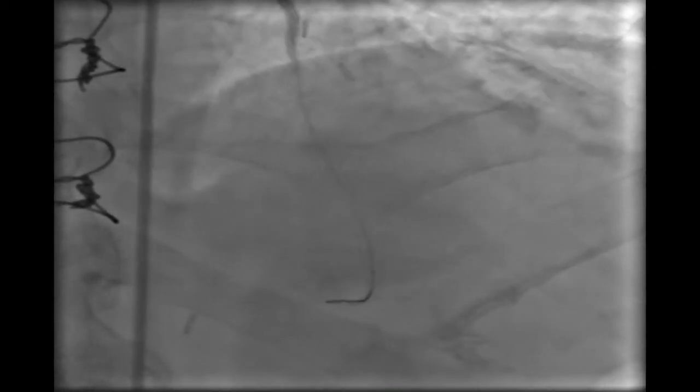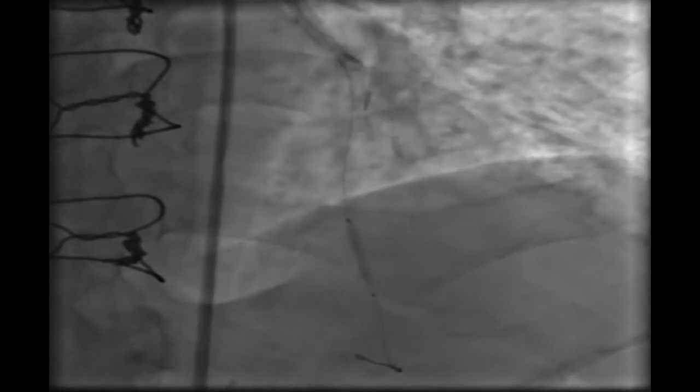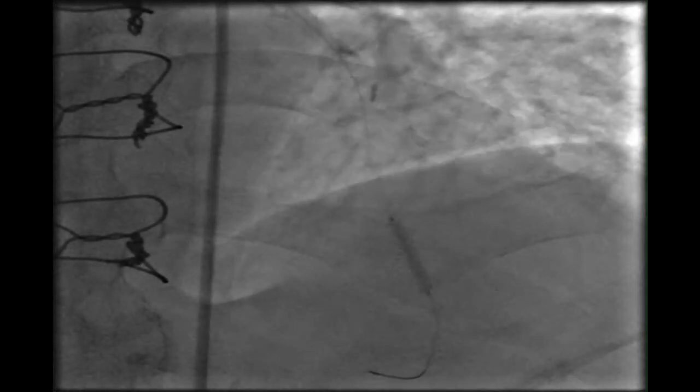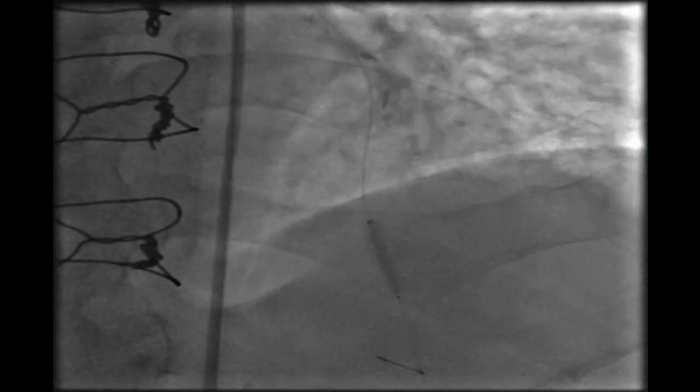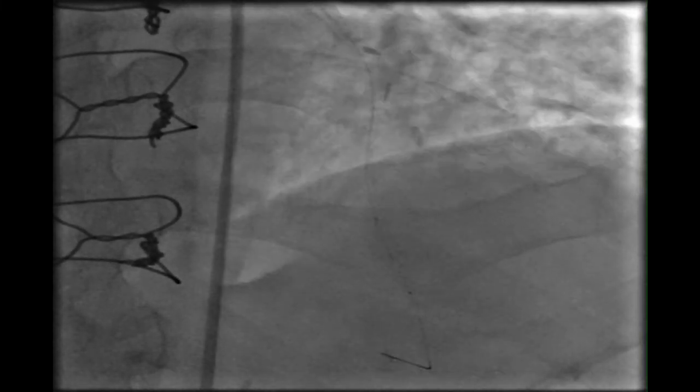These are the two lesions. This is a PTCA by a 2 mm balloon to the distal LAD lesion. And this is the first stent — the distal one — 2.25 mm in diameter.